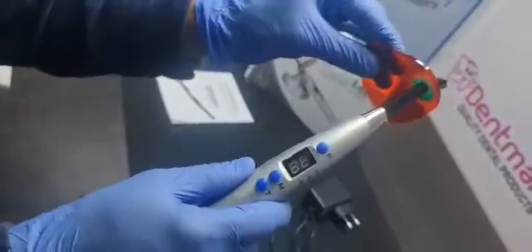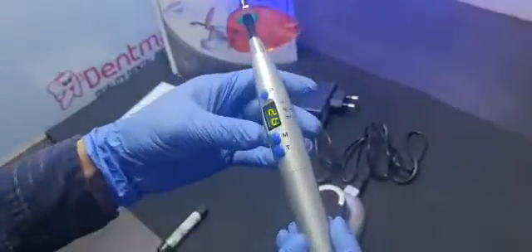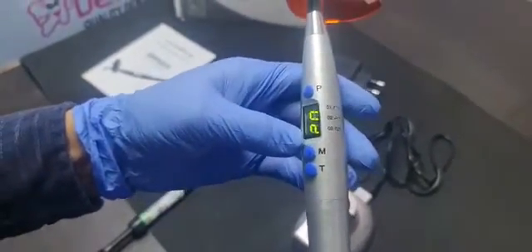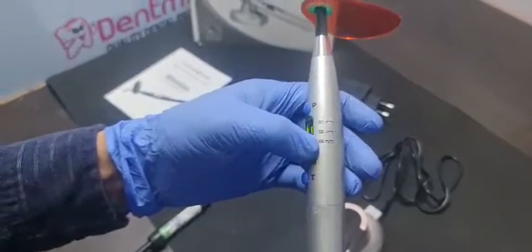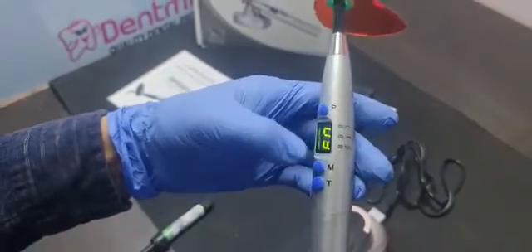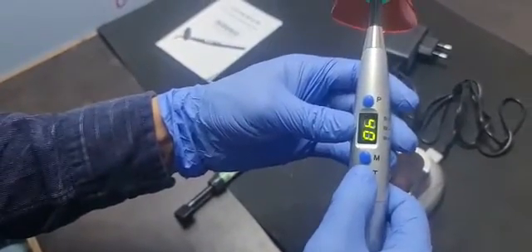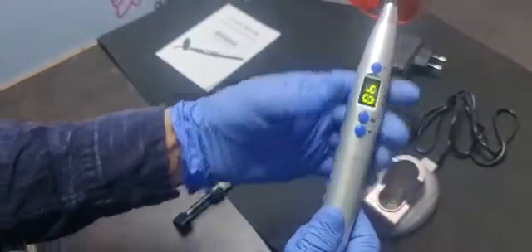This light cure has a UV light protector and three modes: the first is high mode, the second is gradually increasing mode, and the third is intermittent pulse mode. Curing time ranges from 5 seconds to 40 seconds.